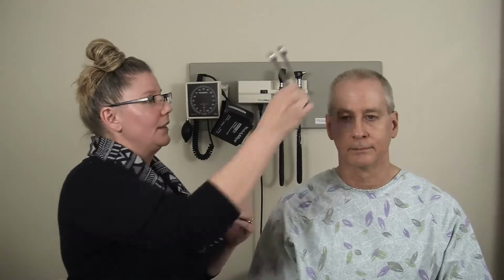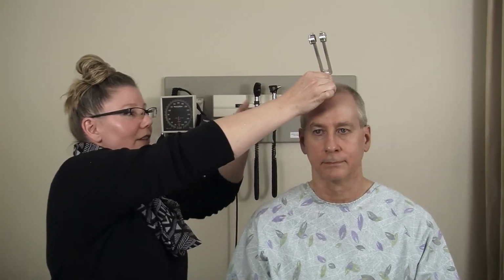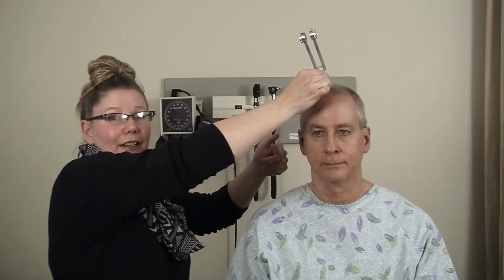Now, if Steve had a hearing loss in his right ear due to a conductive hearing loss, like for example cerumen impaction or a scarred eardrum, when we did the Weber test, it would lateralize to the ear that's affected, the right ear.